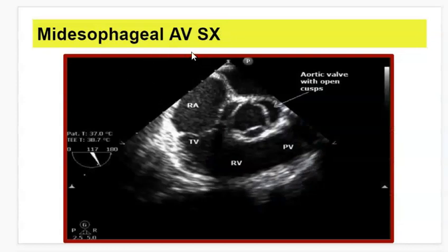This is the mid-esophageal short axis at the aortic valve level, and this here will be on the test, and you can see the angle down here, 0, 180. This is about 117 degrees. The doctor can bring this in. And what we tend to see here are the cusps, the non-coronary cusp, left and right. You can always identify the coronary cusps by location on transesophageal echo.